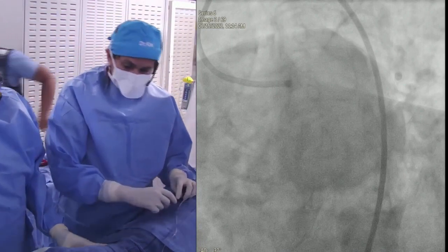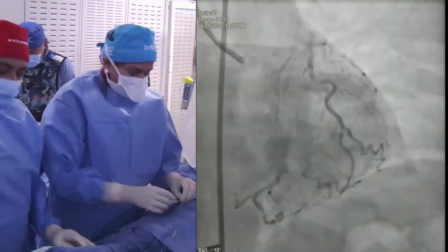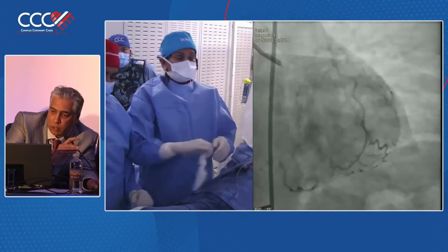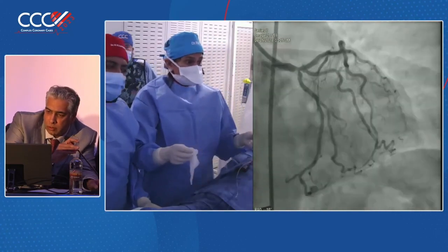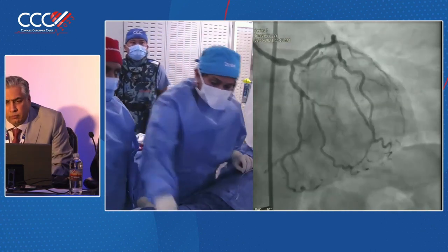I agree, provisional. I mean, the burden of disease in the circumflex is moderate. So you would only stent left main into LAD. Would you use a cutting balloon into the LAD and balloon the other 2 branches? Correct. Okay. Dr. La Sala.